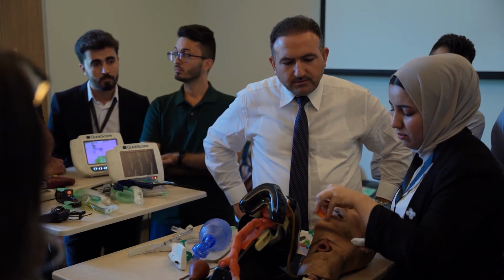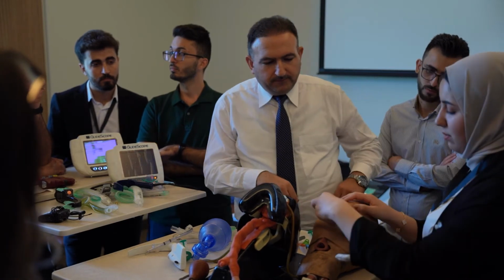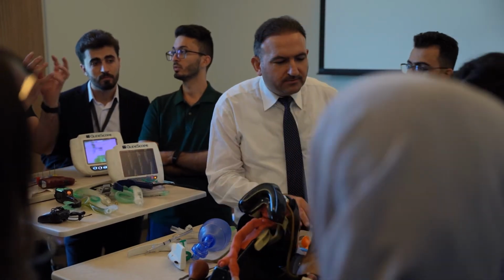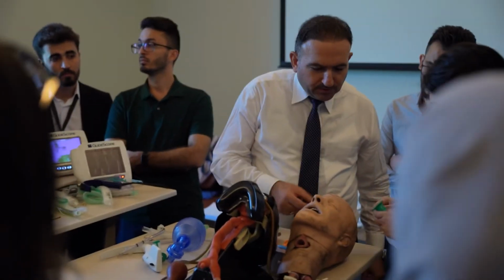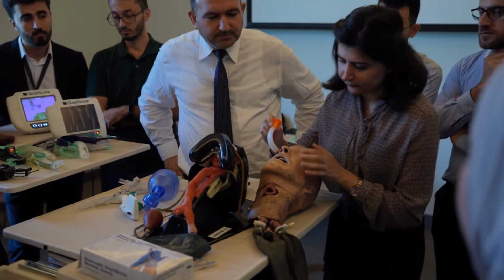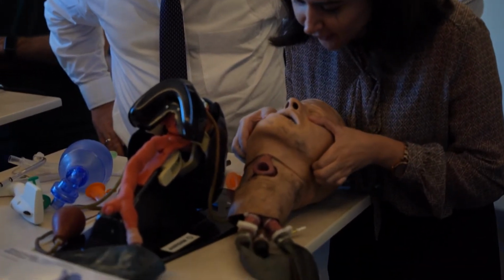And whenever there is anaphylaxis, put in your mind, if the patient's airway becomes compromised, usually there will be difficult intubation. Usually there is edema, swelling, deformity of the anatomy. So you should have a backup of the difficult airway trolley, which contains surgical airway instruments: tracheostomy or cricothyroidotomy. Is that clear?